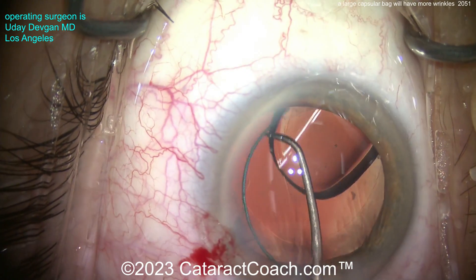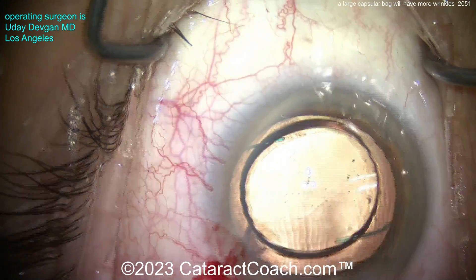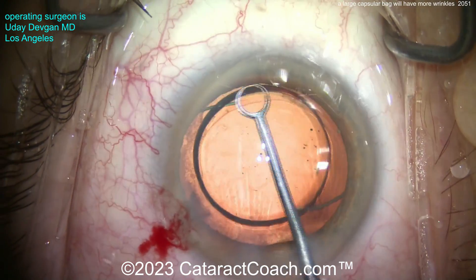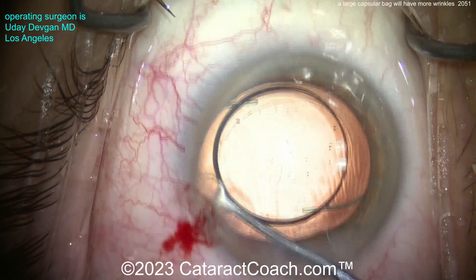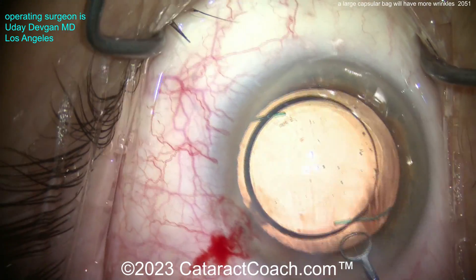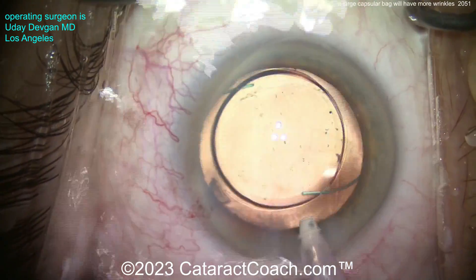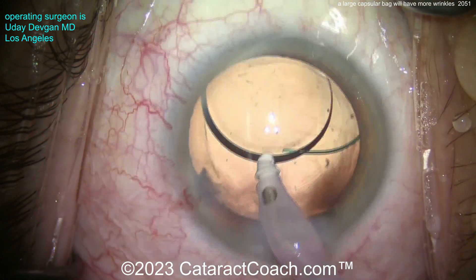Now we'll get that lens delivered in the capsular bag, dial it in. You can see that's a thick lens because this is a meniscus design lens — it's different than the typical lens. If you don't know what that means, go to cataractcoach.com and look it up. Now I'm doing a little capsule polishing to clean up the capsular bag. It's a big bag; I want to be gentle. This is a very large eye with a very long axial length. The patient is getting a minus power IOL, and we're aiming for a post-op goal between minus one and minus two — don't aim for plano in these ultra high myopes.